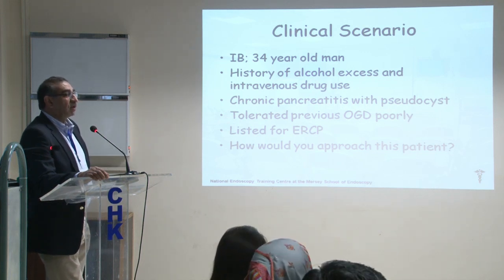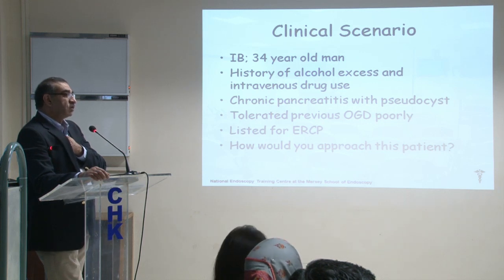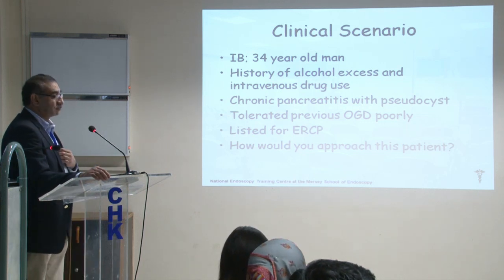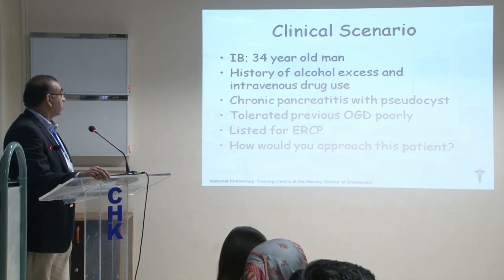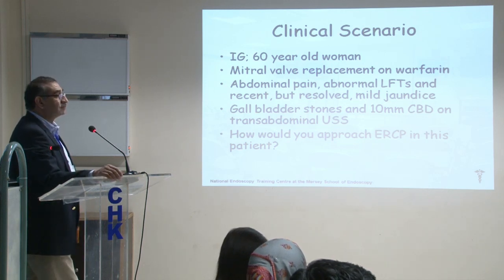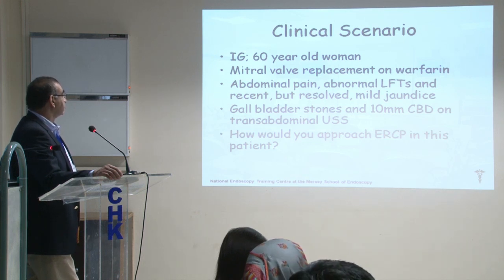I agree, especially if you've got a training unit. You're training people, it's very uncomfortable for the trainer as well as the trainee and the patient. Because the overwhelming majority of our biliary work is done under sedation. But I'm just saying, if I had the opportunity, like he has, I would prefer doing it. And certainly they have shown that their practice is no less safe than what we do with sedation. And not only that, but their procedures become much easier.